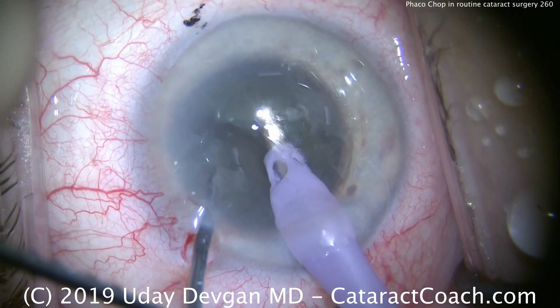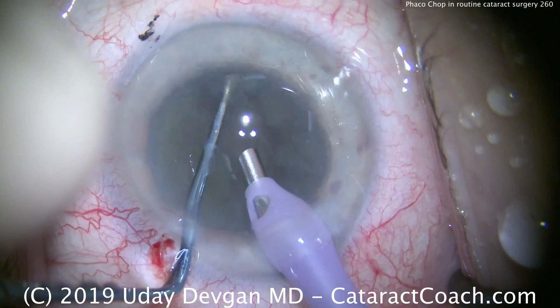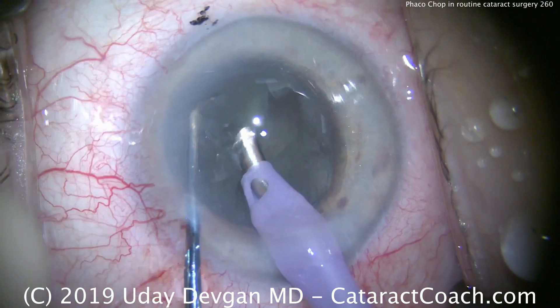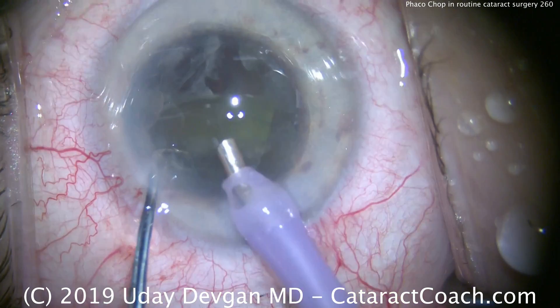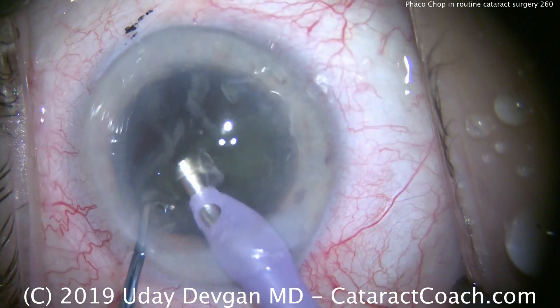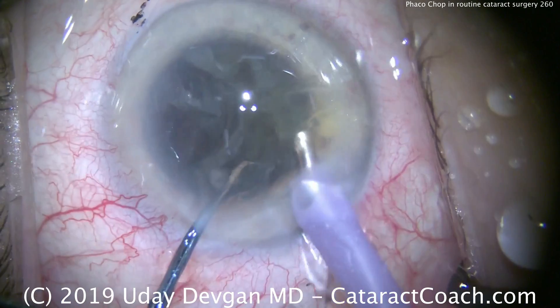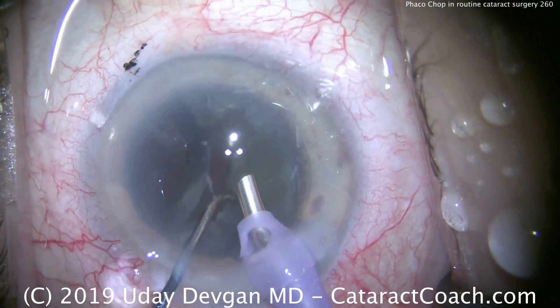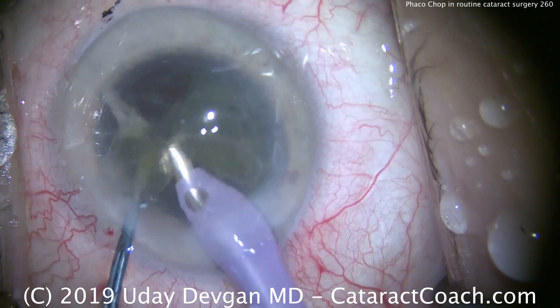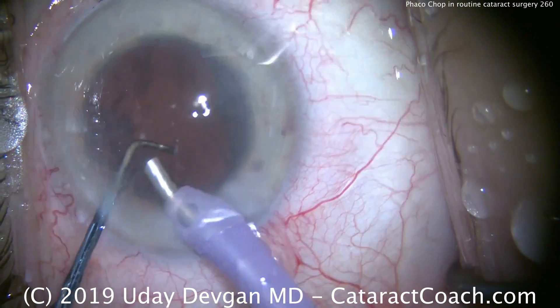Make sure the halves are fully split, then we're going to use vacuum and try to bring that piece up. In this eye it's not actually that easy, so I may have to sub-chop the nucleus more. That first half didn't come up — let's bring the other half up. The nucleus isn't as dense as I thought, so let's just bring the whole hemi-nuclear piece out of the bag and emulsify it here. This patient had more cortical changes than nuclear — it's not a very dense nuclear cataract at all. We'll take that out and then get the second half. With a lens like this, just that one chop at the beginning is probably sufficient. We can feed the remaining nucleus into the phacoprobe and clean it up pretty rapidly.